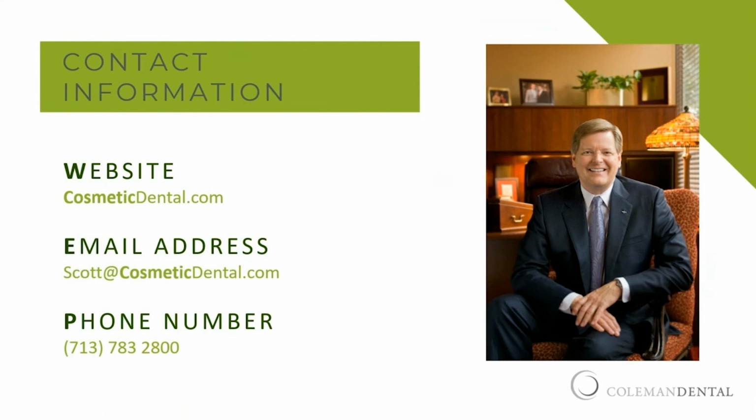Obviously, overhangs are built based on how well your matrix is sealed. And so that's really the key. The composite itself is going to go where the matrix is. And if the matrix is not really tight, then yeah, it's going to flow out and create an overhang for you. Although I guess over the years, I really haven't run into that a bunch, just because I'm used to doing it and I want to make sure that I don't have to go and try to clean one up.